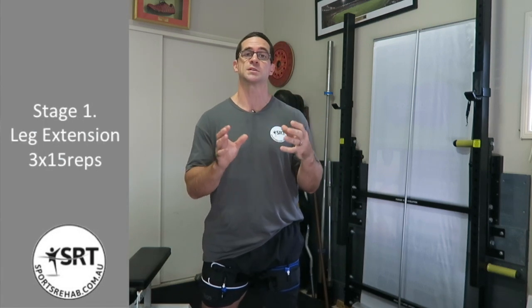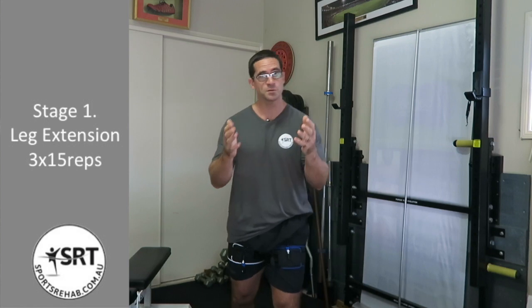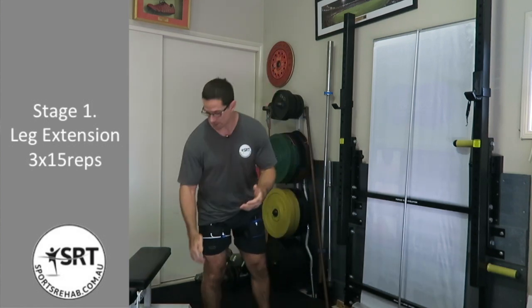I've extended this video to two different stages. The first one is for those who potentially could have quite severe joint pain, and that one will be done in sitting. The other one is more low to moderate type pain, which is myself, and that will be done in standing. The first stage in sitting is really simple, and as with all these exercises, it's quite simple, but I find the sequence with the addition of BFR to be the key in this type of small exercise program.